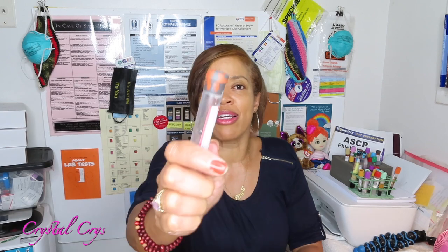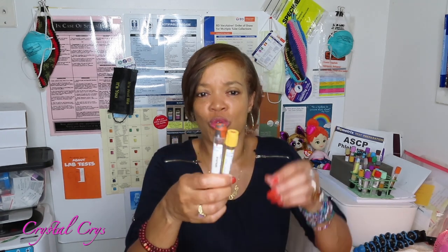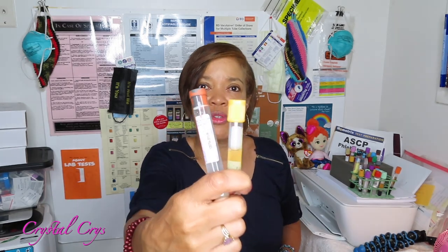The first tube on the card is the gold and tiger top. They call it the tiger top red-gray — a reddish-gray, speckled top tube. Both of these tubes are serum separator tubes. I want to make sure no one is confused thinking these two tubes do something different — they don't. They're going to do the exact same thing: they're going to yield serum.